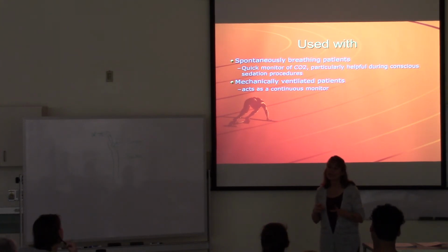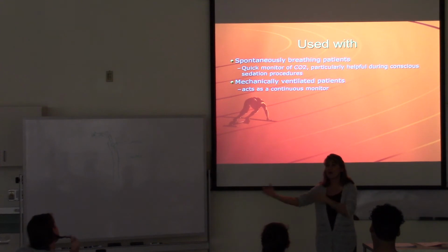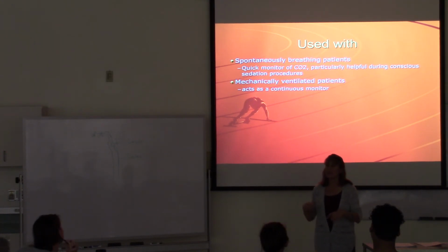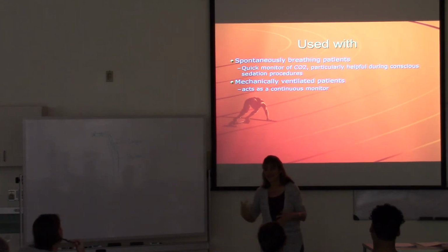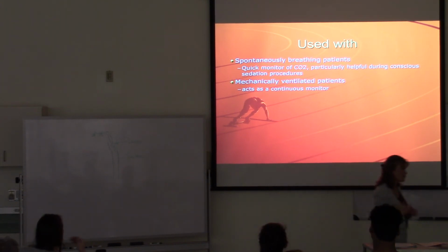So I'm really happy to see now with conscious sedation, where you're awake, you're not intubated, but they're doing a procedure on you. How do they know that you're being ventilated okay? Just putting you on a nasal cannula and getting a good O2 stat doesn't tell you the whole picture. Having exhaled CO2 monitored, they've got your normal while you're awake, and they sedate you. And if that CO2 starts going up too high, that means you're not breathing. They need to wake you up or stop the sedation and let you breathe a little bit more. So very important for conscious sedation.